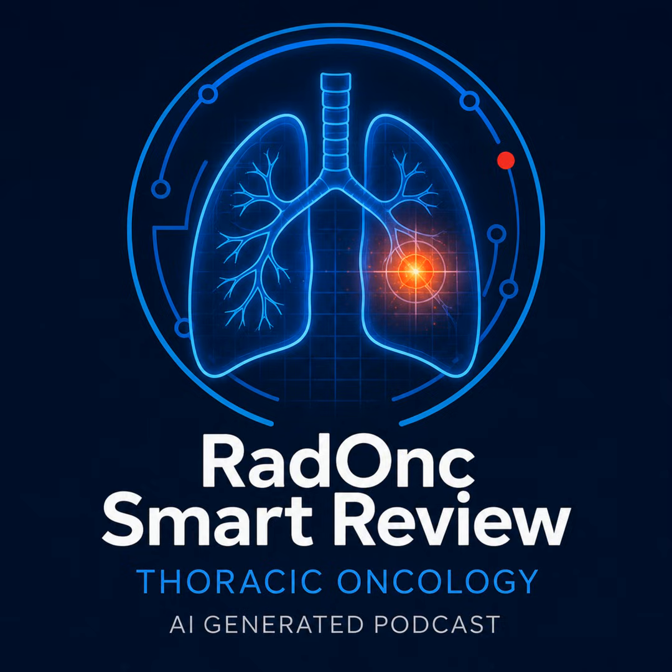Wow, okay. And to round out our data set, let's say the distant staging workup is technically adequate and complete. We have a dedicated thin-slice brain MRI, and it is negative. Beautiful. And there is no distant metastasis anywhere else on the PET-CT. So for you listening, here is the puzzle we have to solve today.